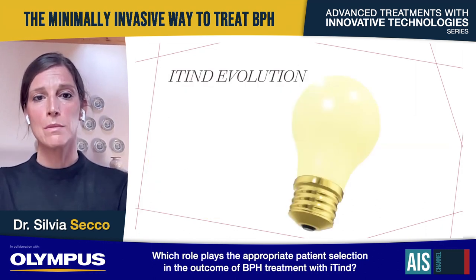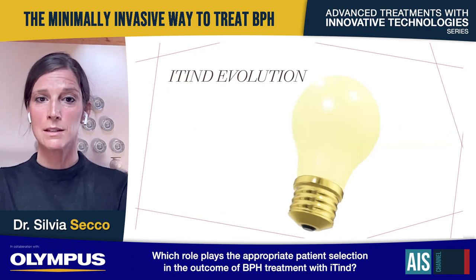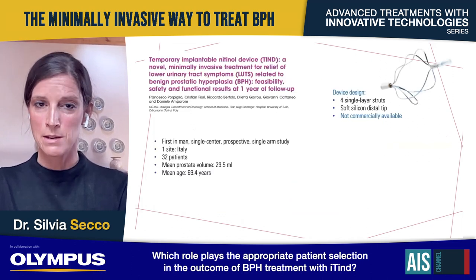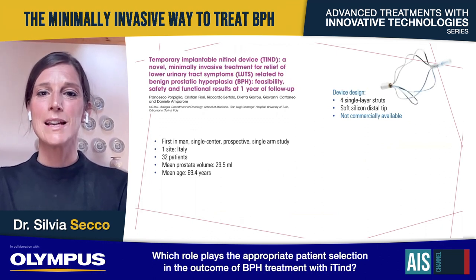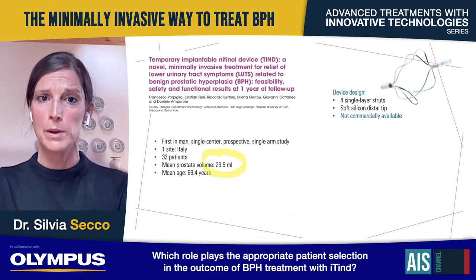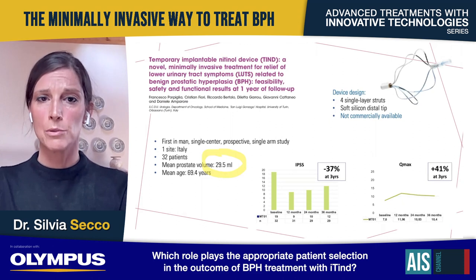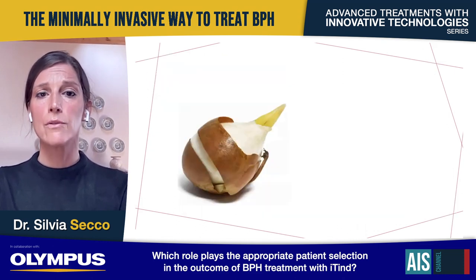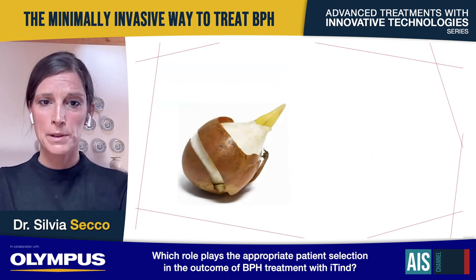iTind is a very, very smart device that has had and is still having a design evolution. This is the first published study involving men, and I'm happy to say Italian men, that evaluated the first available iTind device that was made by four single-layer struts and had a silicone distal tip. Looking at the inclusion criteria, we can see that the mean volume of the prostate was 29.5 milliliters. The results achieved with the very first device were really exceptional, both in terms of IPSS and Qmax. I have mentioned the word evolution, and evolution is growing. This is what has really happened to our iTind.